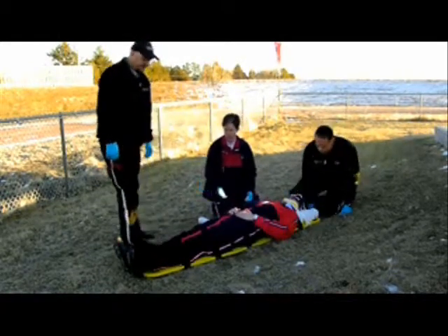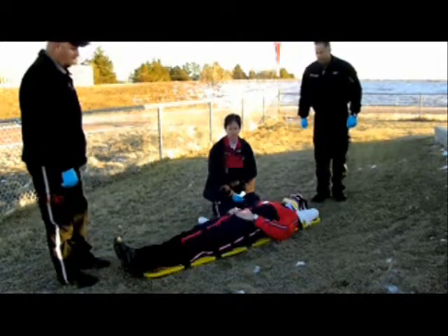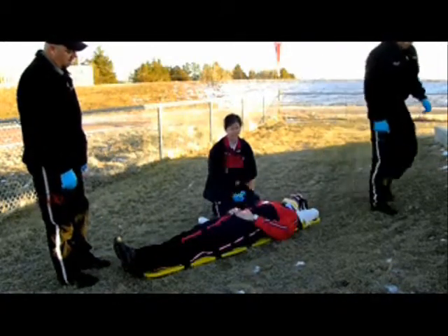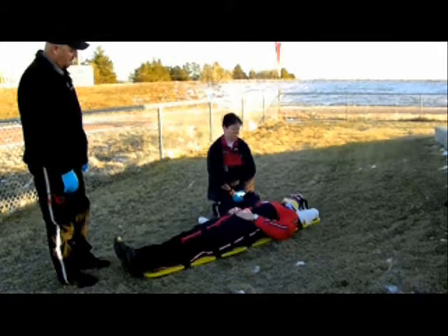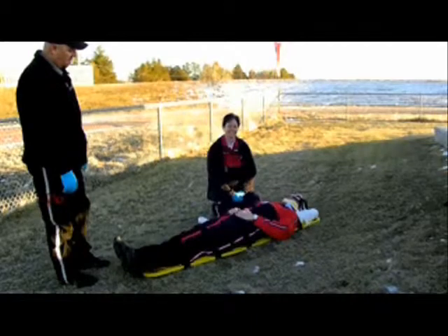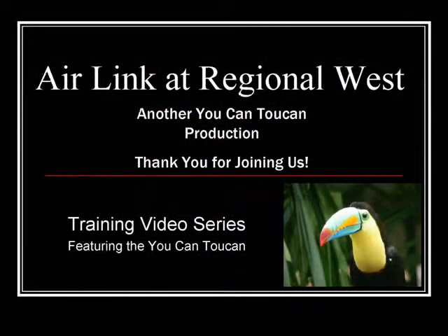Now that we have him immobilized, I'm going to go ahead and check distal CMS again before we load him and transport him to the receiving facility. Thank you for joining us for another You Can, Toucan presentation. Thank you for joining us.